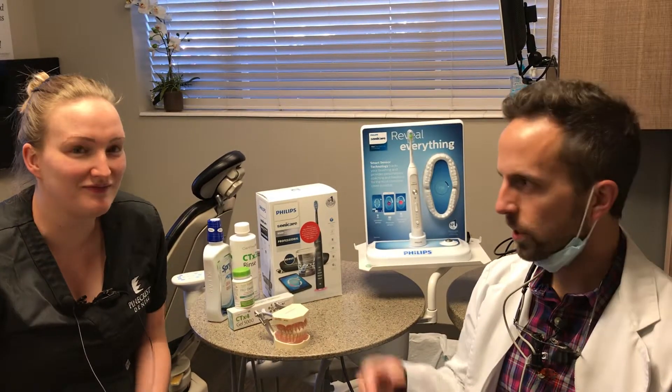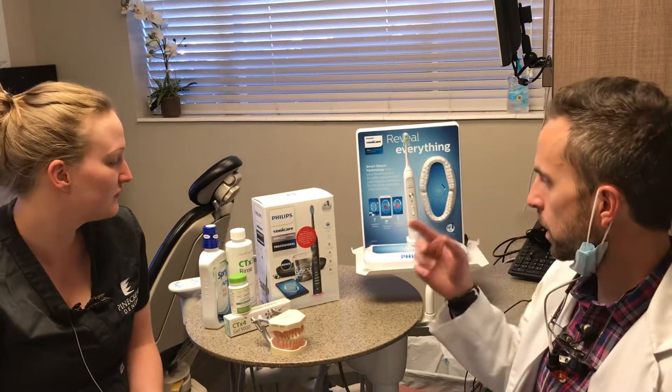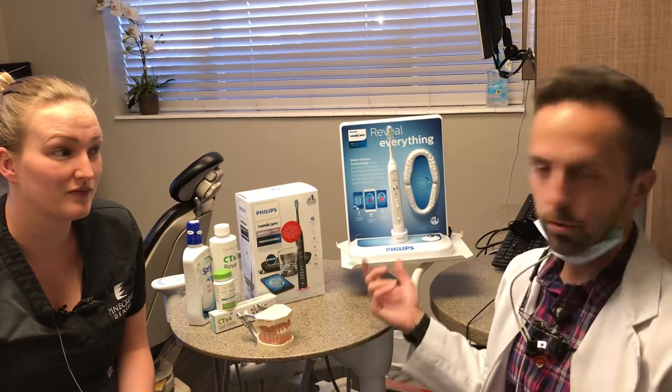We have our wonderful hygienist Michaela here today, who's our guru for all things home health and oral hygiene. We're going to talk about a couple of products, mainly an electric toothbrush. You may have one already, or maybe you don't, but there are some advantages to using one. One that I've used for a number of years and really like is the Sonicare — there are other good ones too, but this is my favorite right now.